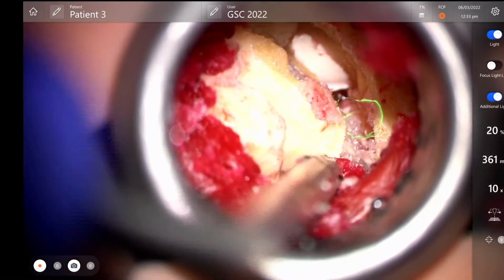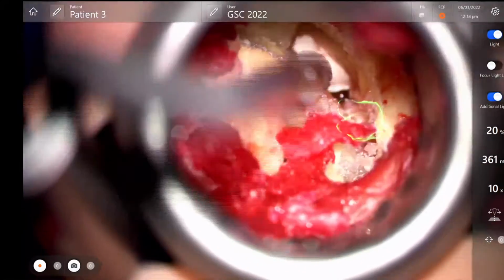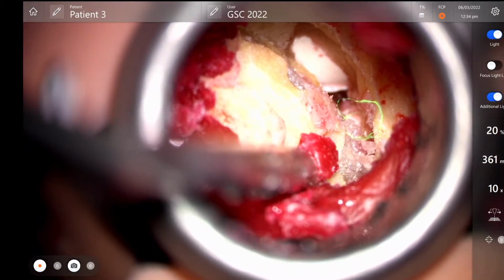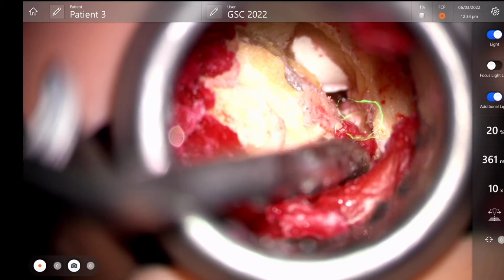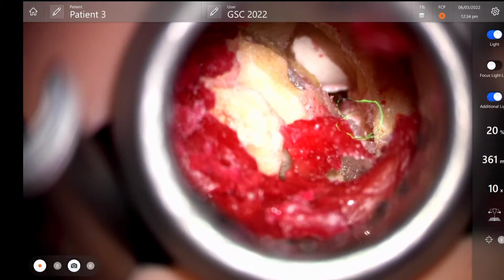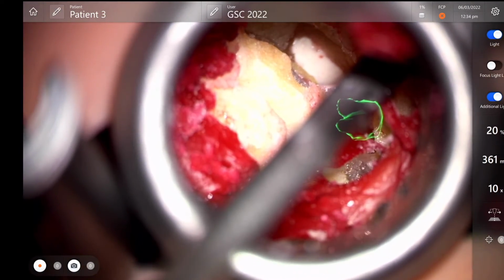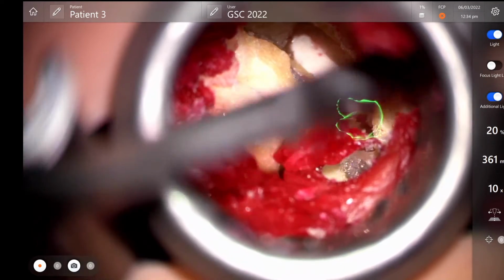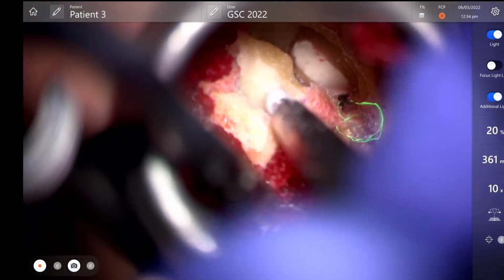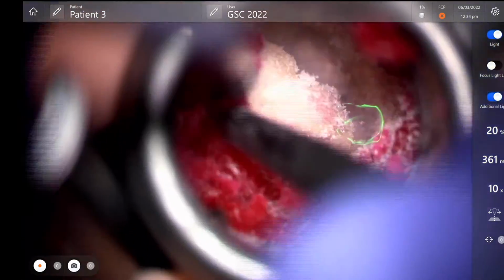Give that to you. So now we're looking at the facet joint. And can you see those? Oh, you can see that yellow spot here. That's the pars. That's where we wanted to drill to, and that's what we did. So again, augmented reality, if you have it, if it works, it really helps you identify bony landmarks and makes the procedure just a little bit smoother at this point. Or for teaching purposes, it really helps you convey that to your residents and to your fellows. So I'm drilling a little bit into the facet joint here.